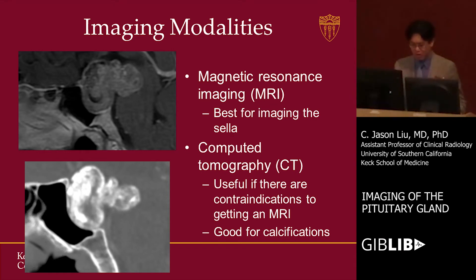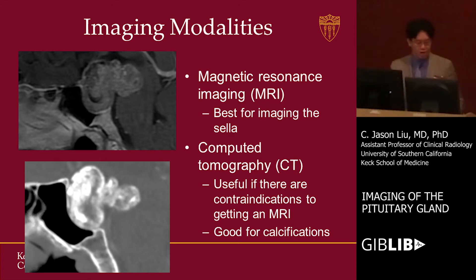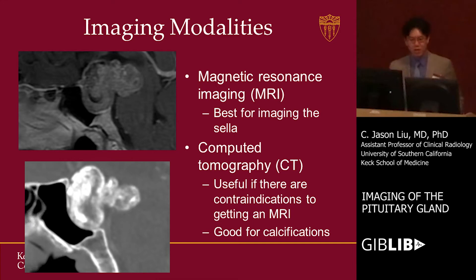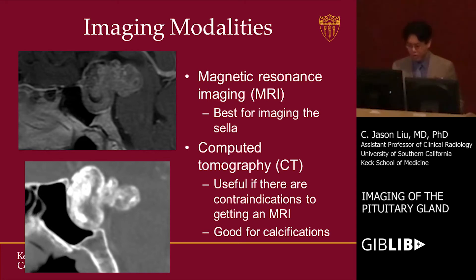As we can see from this example, there is a large sellar-suprasellar mass. We can define its borders very well, its contrast enhancement pattern, and more importantly, what it's doing to the surrounding structures. In this particular case, it's actually indenting on the brainstem, as well as having a lot of mass effect on the optic chiasm. Having that exquisite detail of what the tumor looks like and what it's doing to surrounding structures is very important. As of now, MRI is certainly the imaging modality of choice.